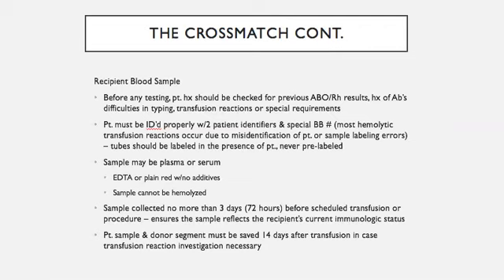And it serves kind of as a double check also. If you've got a record of this patient in your medical record system that says that the patient's type A positive, and then you test it and you're coming up with A negative, then that's a discrepancy that you would need to resolve. So all of that information kind of serves as a double check.